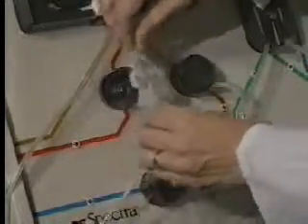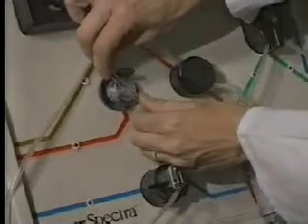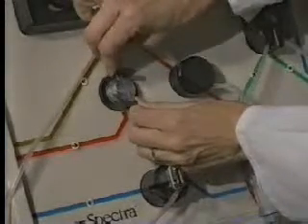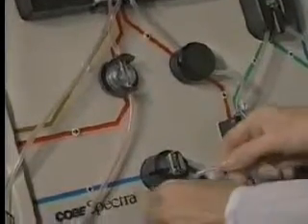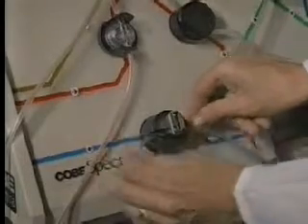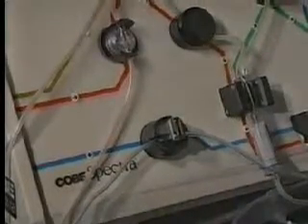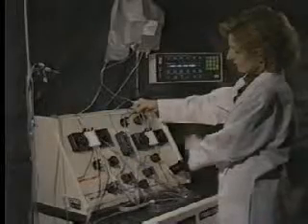Next, place the access pressure sensor in the access pressure sensor housing. Push down and turn clockwise to lock in place. Finally, insert the return line in the return line valve. Use a flossing action to ensure proper loading. Now that you have loaded the front panel portion of the disposable set, let's review the process.